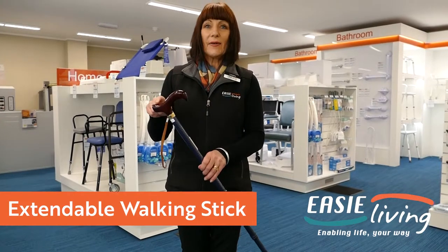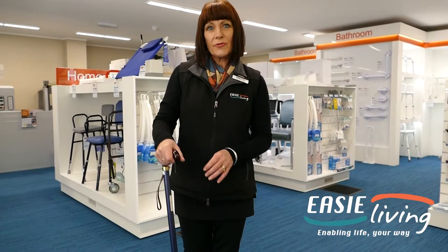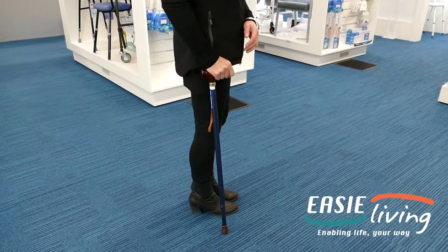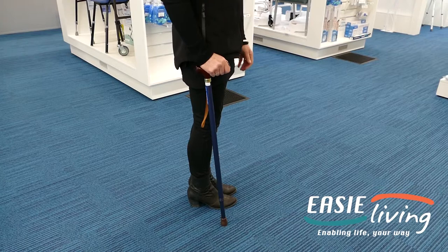Here we have a t-handled walking stick. This is a very comfortable handle for your hand to sit in. You can adjust the height to where you need it to be. The height should be at an angle where it reaches your hip line, so you're not bending when you're walking.